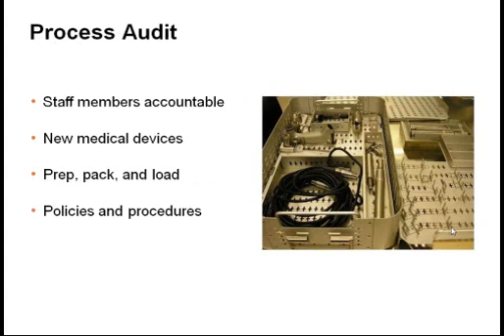Process audits can be valuable with the investigation of wet packs. Review policies and procedures with staff members along with education and training, which will validate staff competencies. Do not use disposable towels and packs. Fabric softeners and ironing towels can diminish absorbency of cotton textiles. Changes in wrapping materials and the introduction of rigid sterilization container systems can result in wet packs. Porous textile wrappers permit revaporization of moisture easily at the end of the sterilization process compared to a non-woven disposable wrap or rigid sterilization container. Staff members should be held accountable for following the correct procedures in preparation, packaging, and loading of the sterilizers.